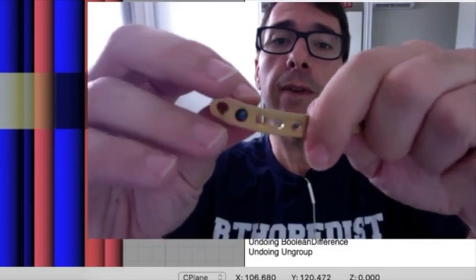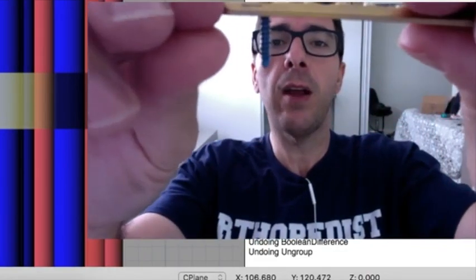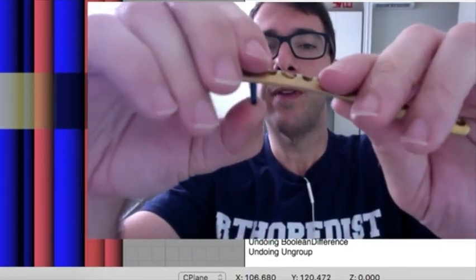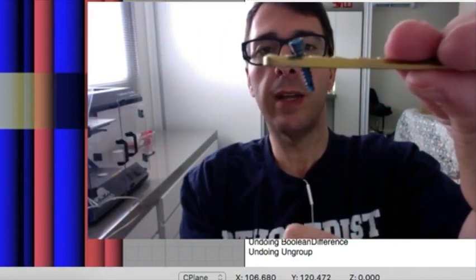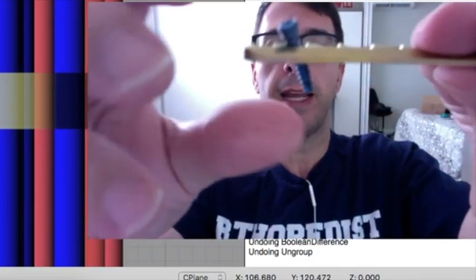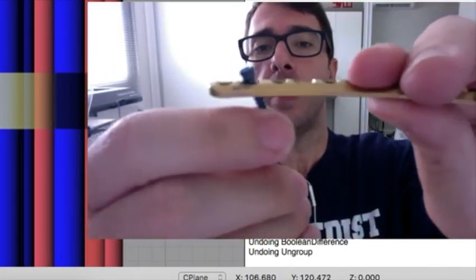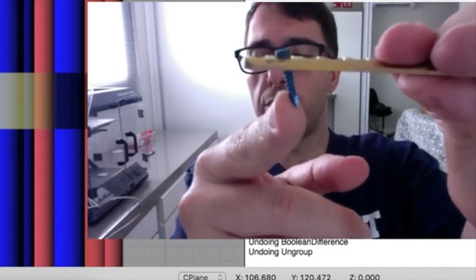But if we had a screw with a different angle of position, for example, if we have a screw with 30 degrees of inclination, we could just change it. It's very easy. We have to measure it. We can take pictures and measure the inclination. It's very easy to measure the inclination in ImageJ, just as I showed you.